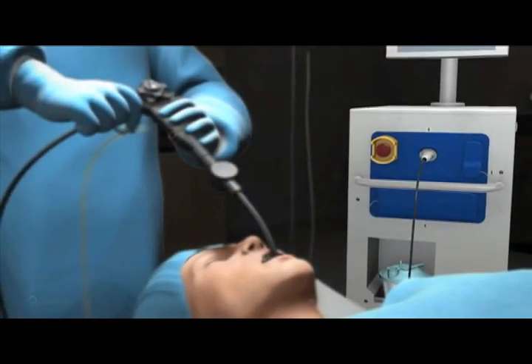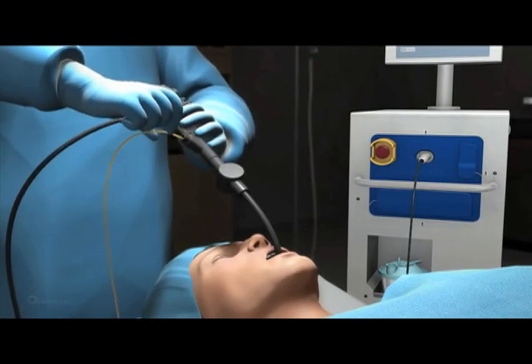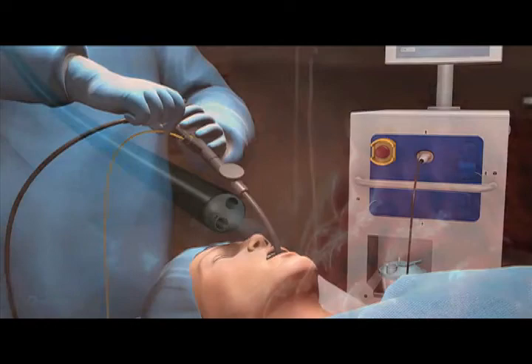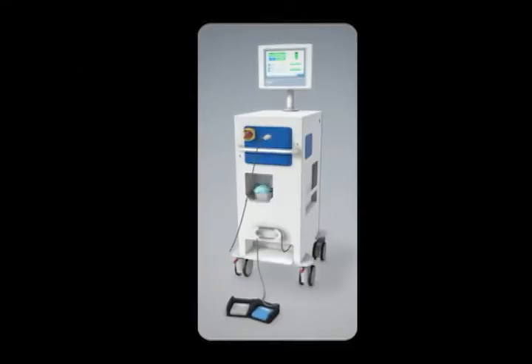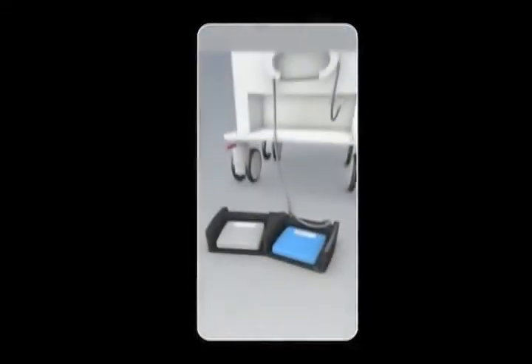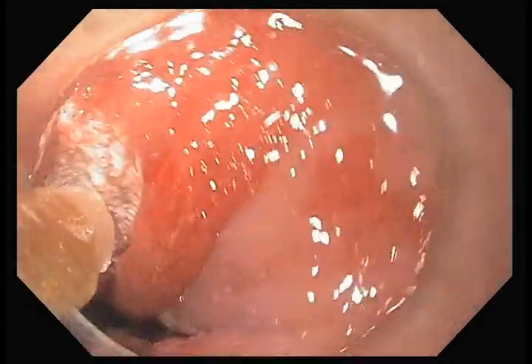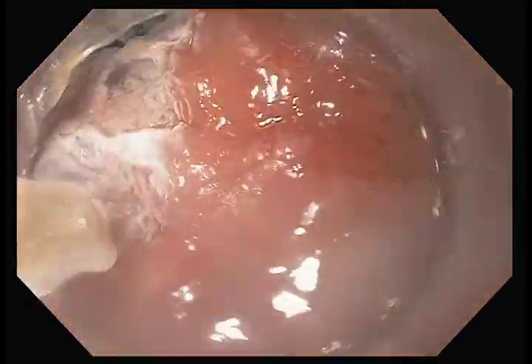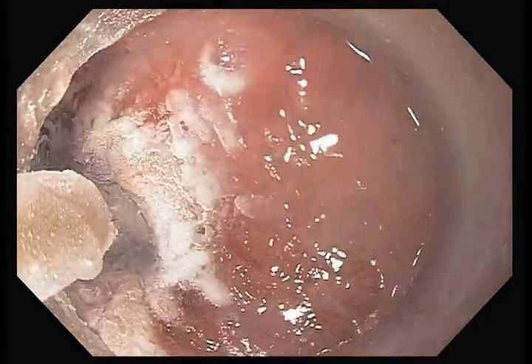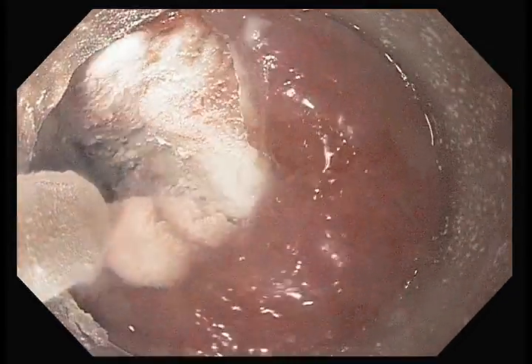Next, a specialized TrueFree spray cryotherapy catheter is inserted through the working channel of the scope and advanced to the target ablation site. The physician activates the flow of cryogen by depressing a foot pedal attached to the TrueFreeze console. Extremely cold liquid nitrogen exits the catheter in a low-pressure spray, enabling touch-free ablation of targeted cells and abnormal or obstructive tissue.